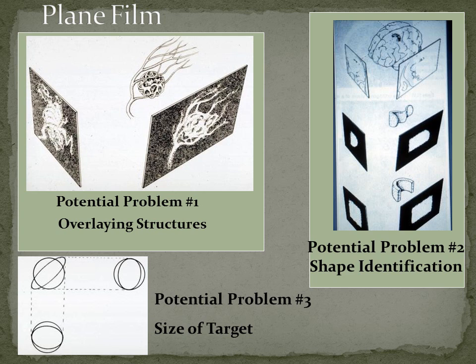And because these objects are not regular, and it's very, very difficult to pick out the exact same spot for the entire surface of the nidus, all you could do is say, I know where the middle of it is here, and I know where the middle of it is here, and I can project back and I can find the middle of this, but I can't tell you where the surface is. Nor can I be sure exactly what the shape is, because on 2 projections, you can't do that.